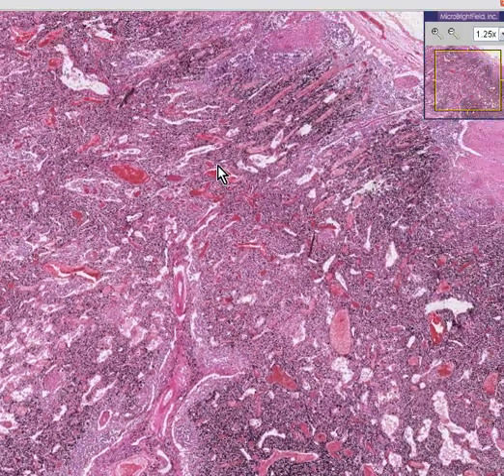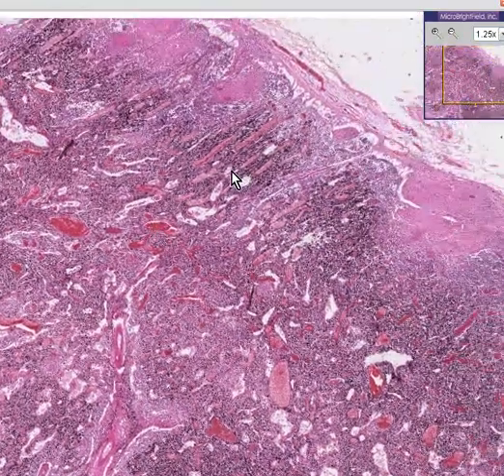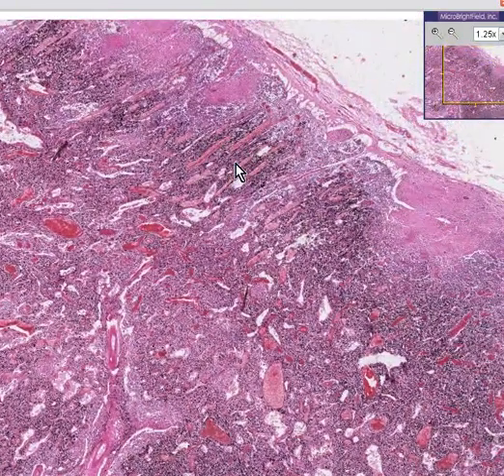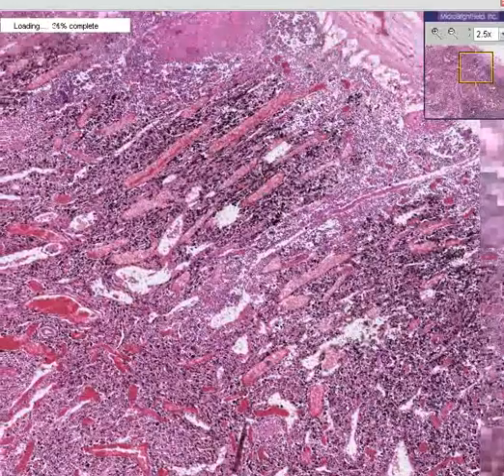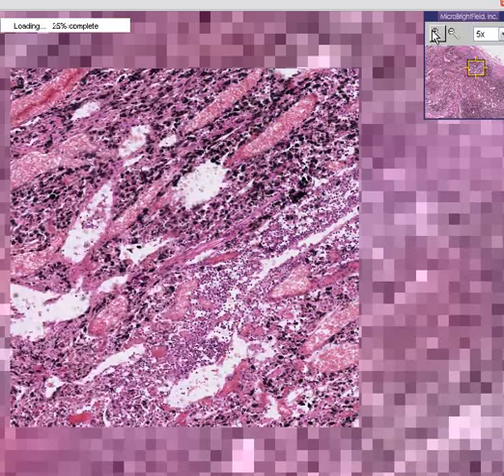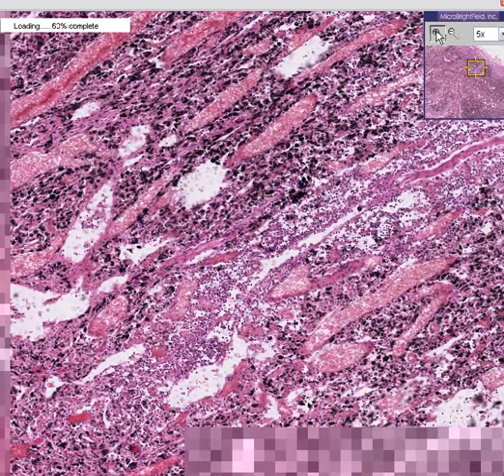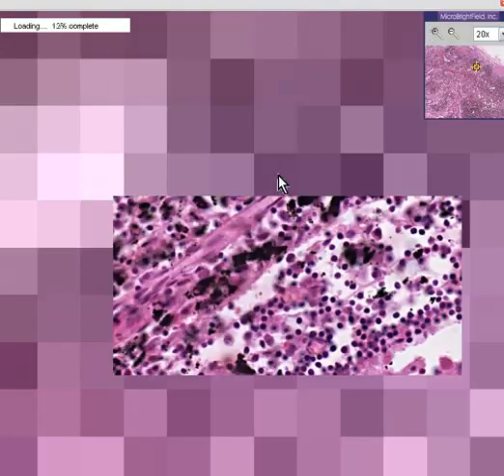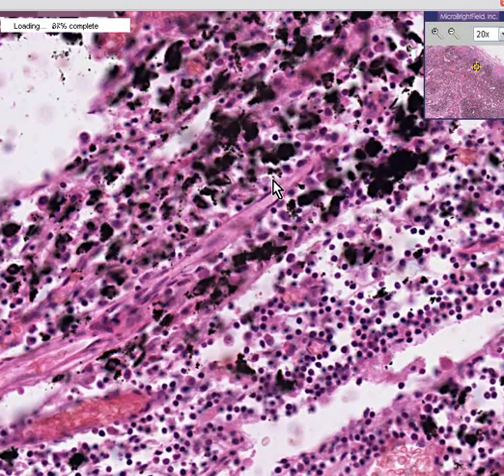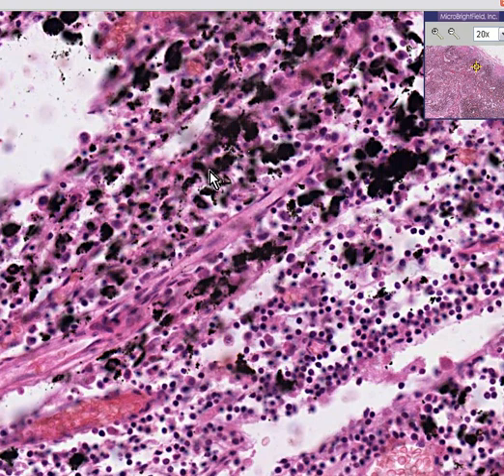There are two things abnormal about this lymph node. One is the presence of dark staining within the macrophages or histiocytes. This is not a golden brown pigment like you see with hemosiderin or bile — this is intensely black. This is soot, this is anthracotic pigment, this is anthracosis of the lymph node.